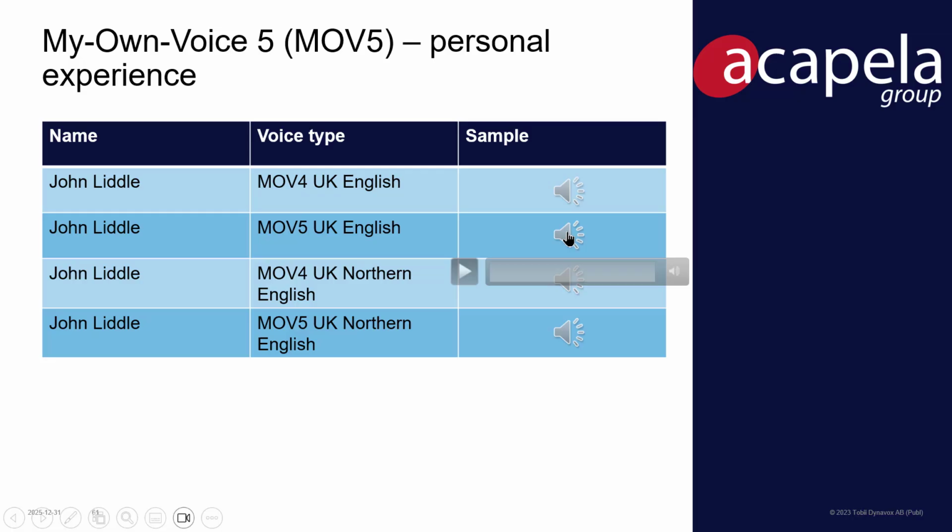And now version 5. He took a fast bus to go home and have a bath after slipping on the grass. My Own Voice 5 UK English.